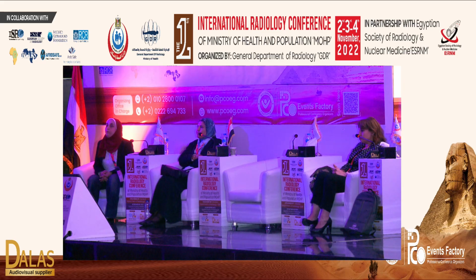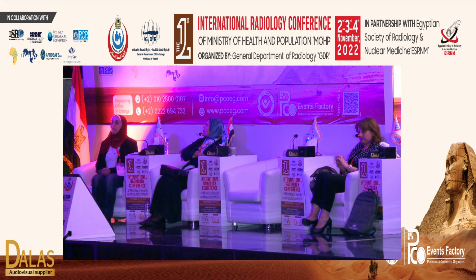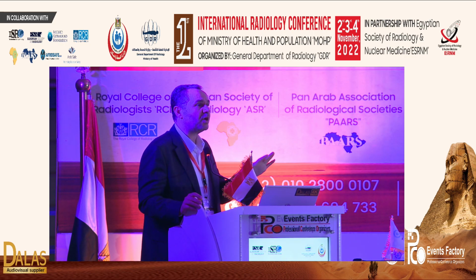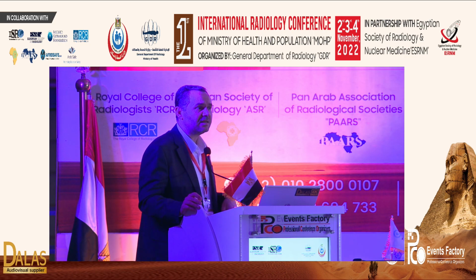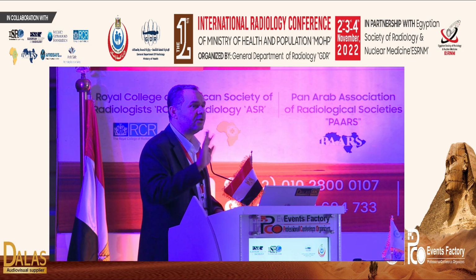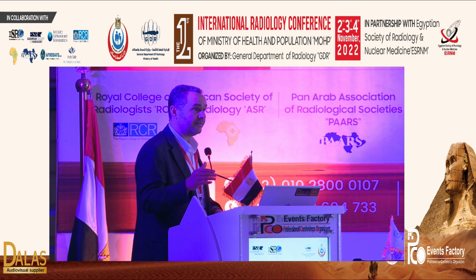Sure. That's another great question. In routine cases, especially oncology patients or patients with Crohn's disease coming to ER, I tell our residents, if the patient's coming to ER with abdominal pain and they want to rule out acute findings, then we do it with positive contrast. But if they want to assess disease activity, especially in inflammatory bowel disease, we give the neutral contrast. It's completely different in different institutions, but at least in my institution, they stopped any oral contrast in the ER setting. The patient comes for appendicitis, any itis, no oral contrast. If the patient is coming through ER, no oral contrast.